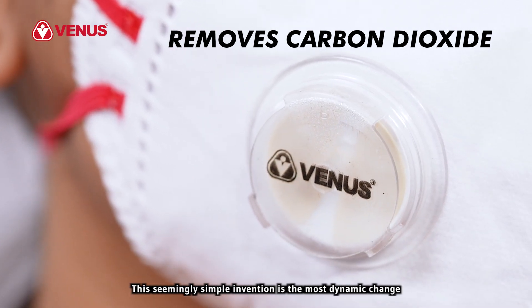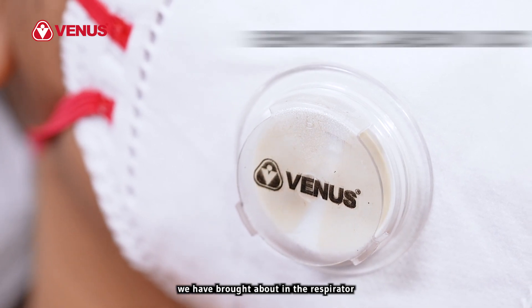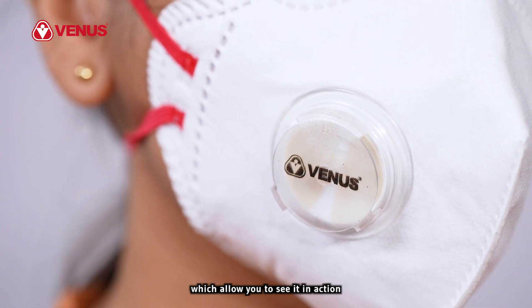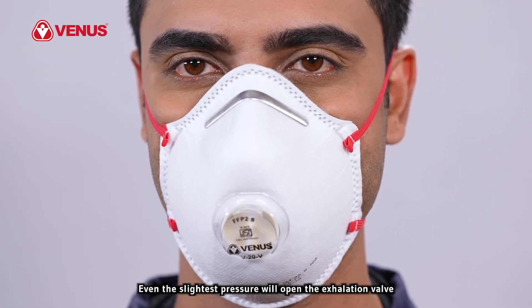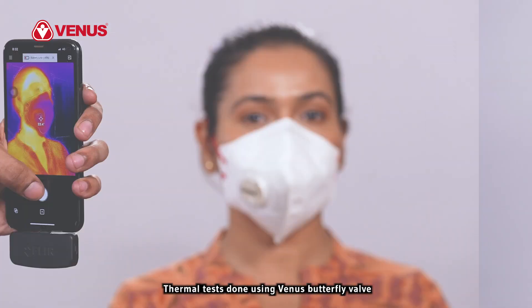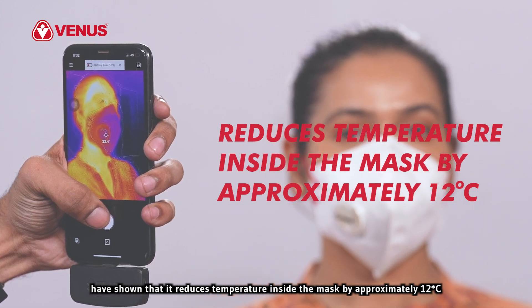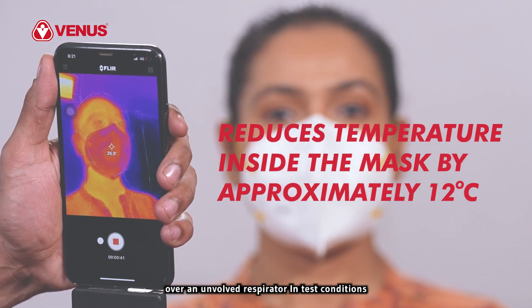This seemingly simple invention is the most dynamic change we have brought about in the respirator. You can even watch your valve in action, as Venus butterfly valves have transparent caps which allow you to see it in action. Even the slightest pressure will open the exhalation valve, and you don't have to work hard for this. Thermal tests done using the Venus butterfly valve have shown that it reduces temperature inside the mask by approximately 12 degrees centigrade over an unvalved respirator in test conditions.